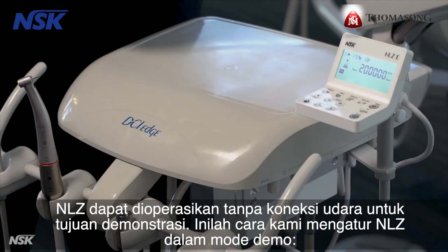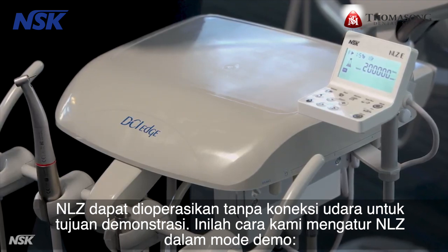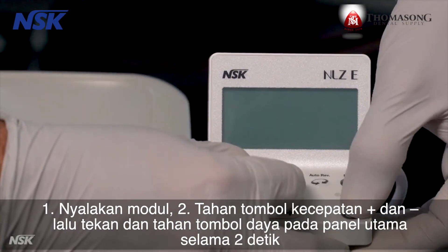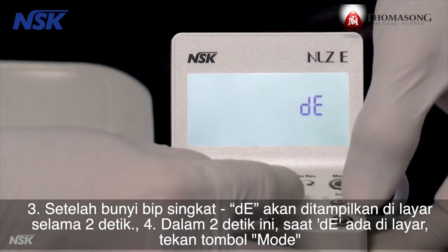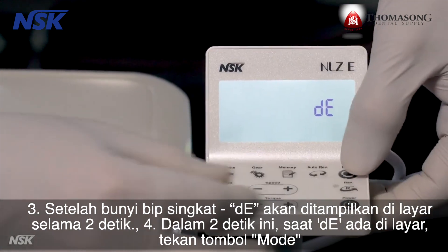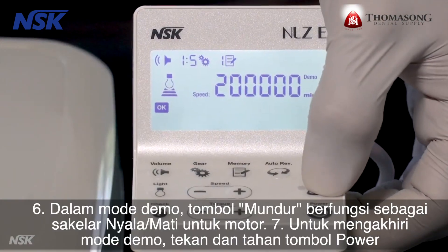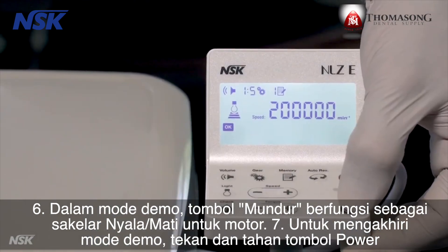NLZ can be operated without an air connection for demonstration purposes. Here's how to set up NLZ in demo mode: turn on the module, hold down the speed plus and minus buttons, then press and hold the power button on the touch panel for two seconds. After a short beep, DE will be displayed on the screen for two seconds — within those two seconds, press the mode button. Demo will start blinking on the screen to indicate you've successfully entered demo mode. In demo mode, the reverse button works as the on-off switch for the motor. To end demo mode, press and hold the power button.